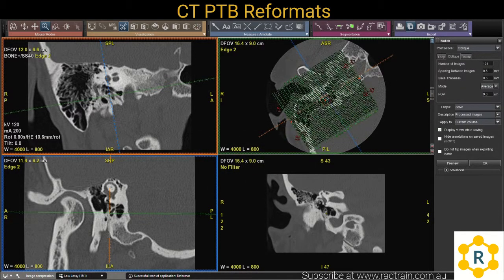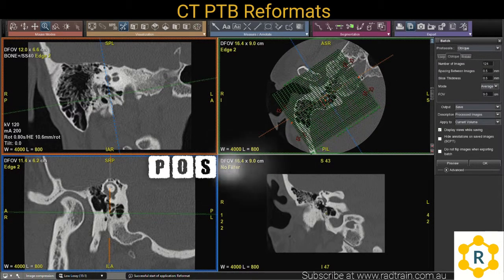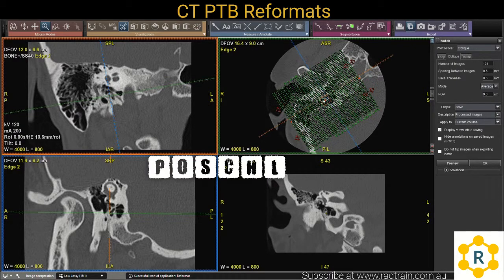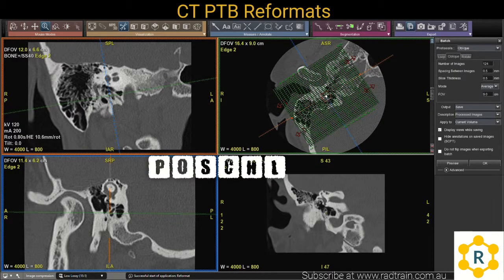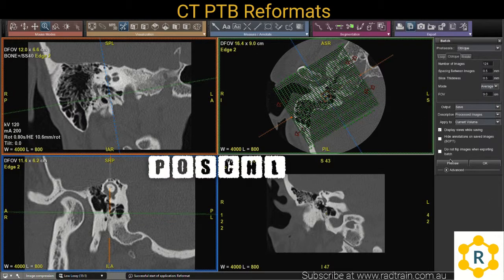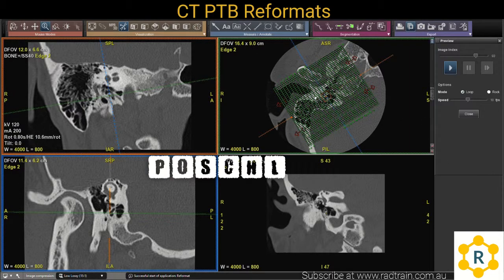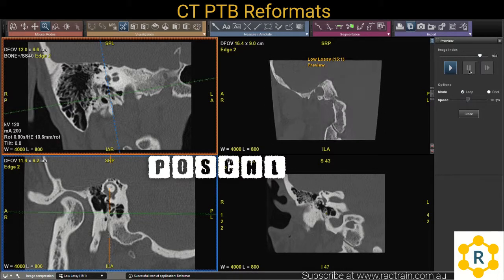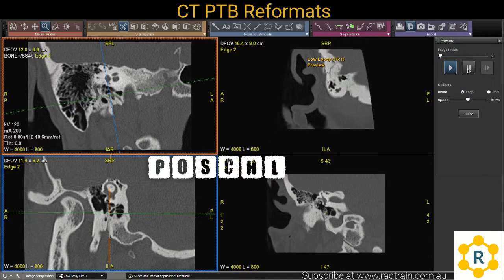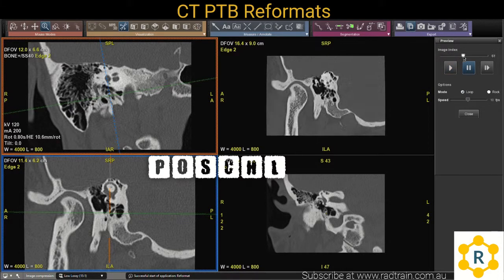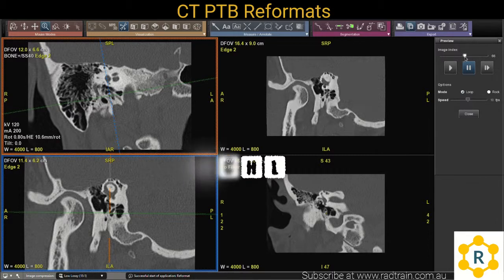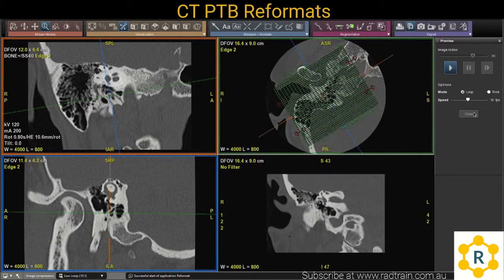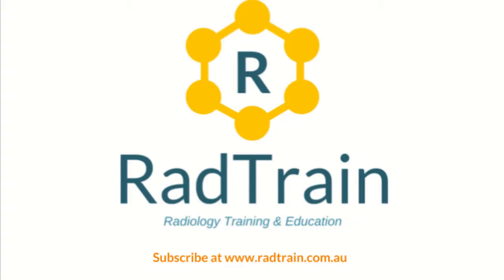The next one is our Pöschl view. Basically what I'm going to do now is angle my batch slab to the blue multi-oblique line, and what we should get is an identical picture to the one in the bottom left corner there. Again, what you're looking for is a complete ring of the superior semicircular canal — that's a good indication that you've got the angles right.